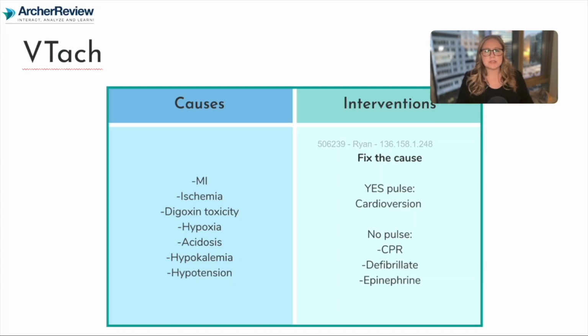As I mentioned, this client can have a pulse. They don't always have a pulse. And that's the first thing I need you to do. Check for that pulse for 5 to 10 seconds. You never want to delay intervention greater than 10 seconds. If you can't feel a pulse in 10 seconds, you're going to proceed to that ventricular tachycardia without a pulse.